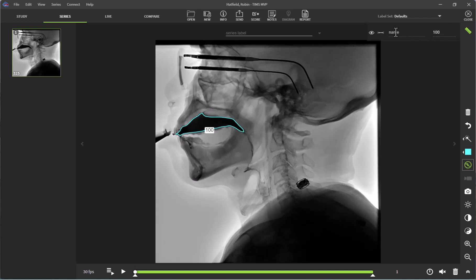Let's say that this is thin liquid. To hide this from view so that I can move on to my next measurement, simply click the eye icon.